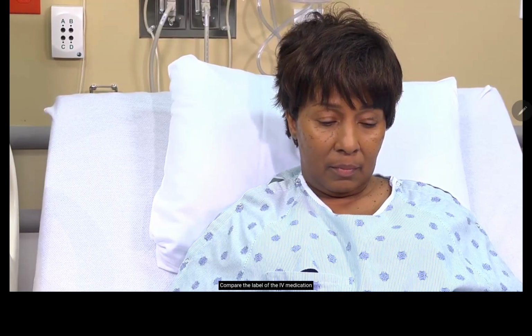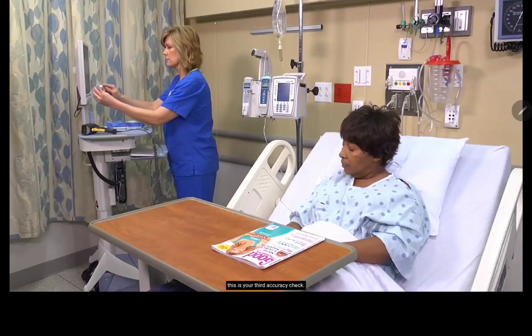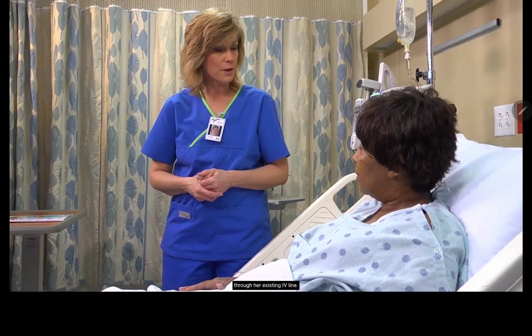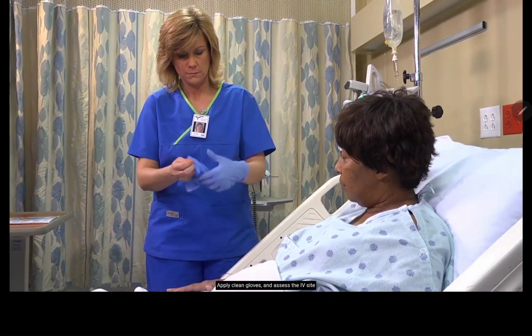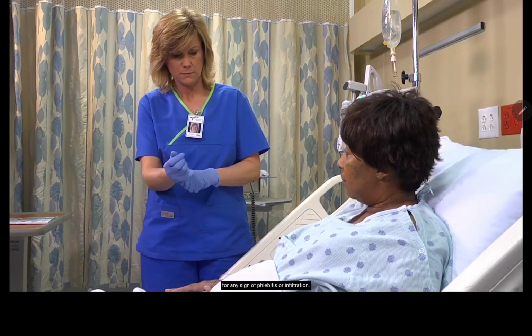Compare the label of the IV medication with the information in the MAR. This is your 3rd accuracy check. Discuss the drug's purpose, action, and possible side effects. Explain that you'll be administering the medication through her existing IV line. Give her a chance to ask questions and encourage her to tell you if she feels any discomfort at the IV site. Apply clean gloves and assess the IV site for any sign of phlebitis or infiltration.